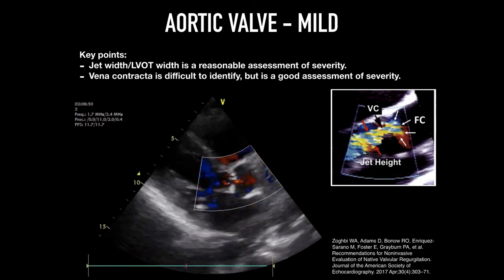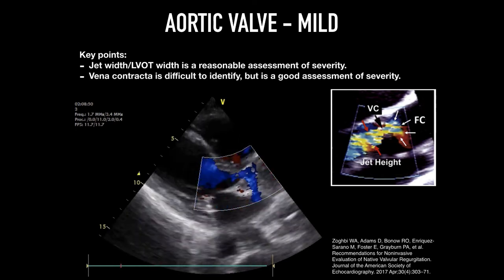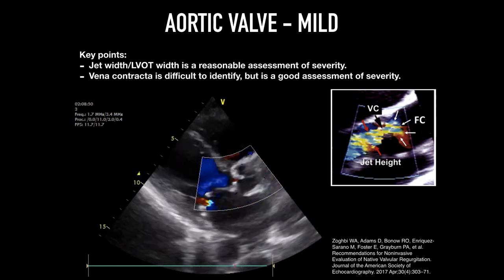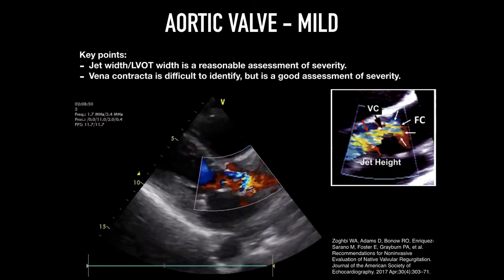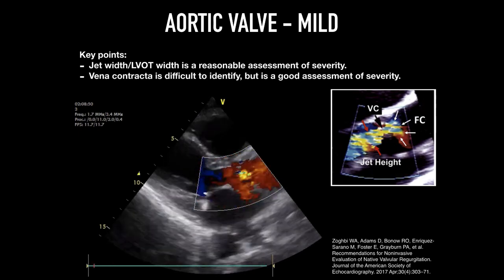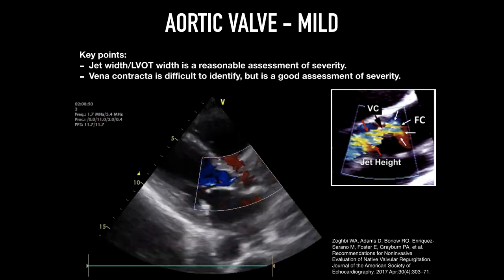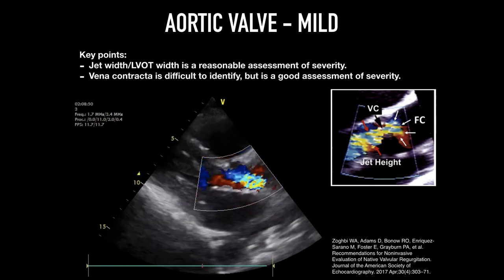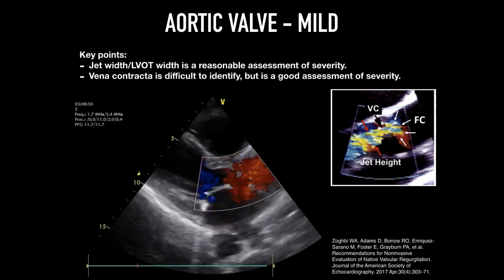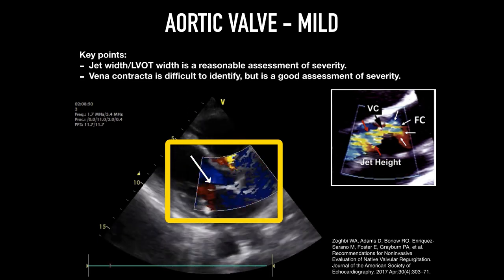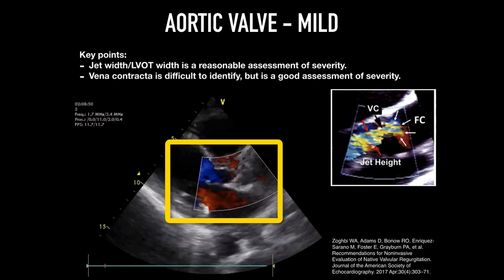A large vena contracta — more than 0.6 cm — means severe AR. An easier and also reasonable assessment is the jet width divided by the LVOT width: how much of the LVOT space the regurgitant jet occupies. A jet occupying less than 25% of the LVOT represents mild AR, while a jet representing more than 65% represents severe AR. In this clip, you see a thin, linear regurgitant jet in keeping with central mild AR.